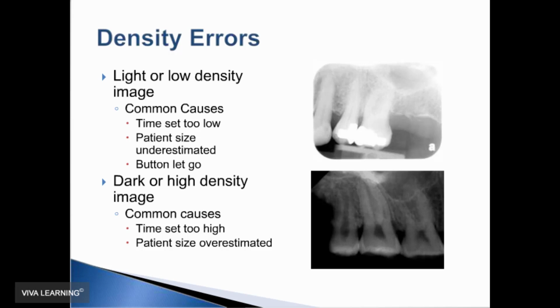When images are too dark, sometimes it burns out information that we would like to see on the image. With a digital receptor, you can subtract density or darkness from each pixel and salvage the image as long as it's not completely dark and overly exposed.